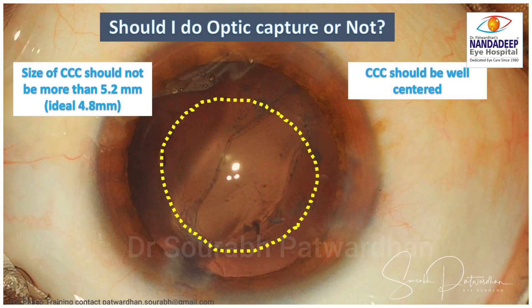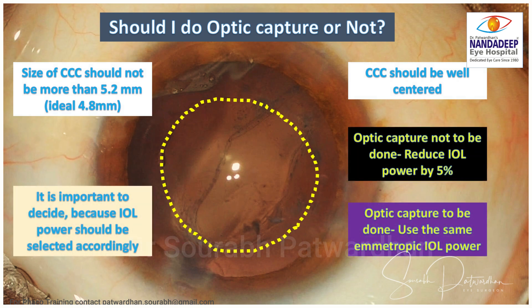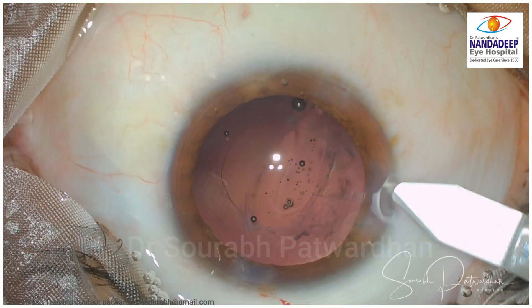I am going to place the IOL in the sulcus, but should I do optic capture or not? That depends on the size of the CCC. If it is small — ideal is 4.8 mm but it should be less than 5.2 mm — and the CCC is well centered, then I will do optic capture. You have to pre-plan: if you are going to do optic capture, use the same emmetropic IOL power; if not, reduce the IOL power by 0.5 D to achieve the best possible post-operative refractive correction. We don't want the patient to land up with very high hyperopia or myopia.